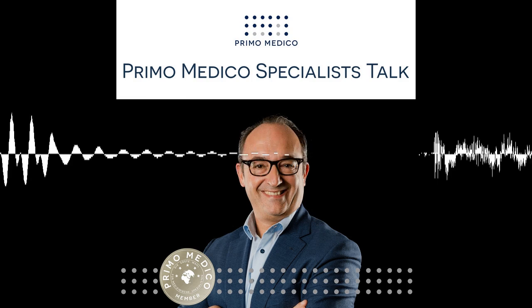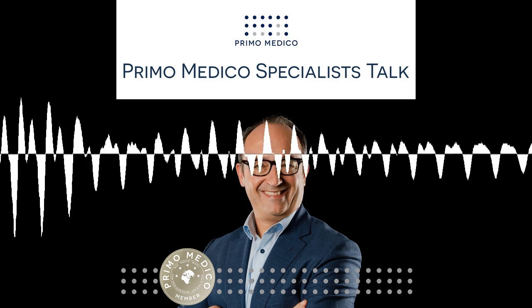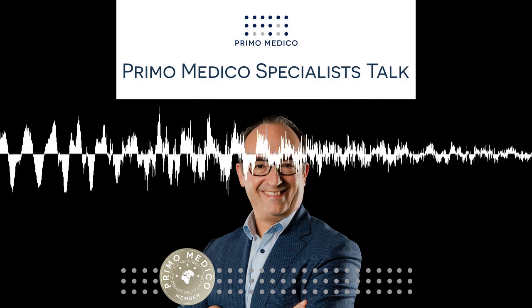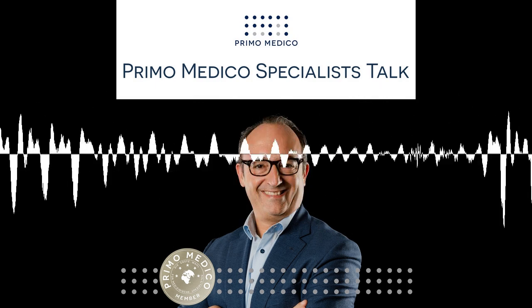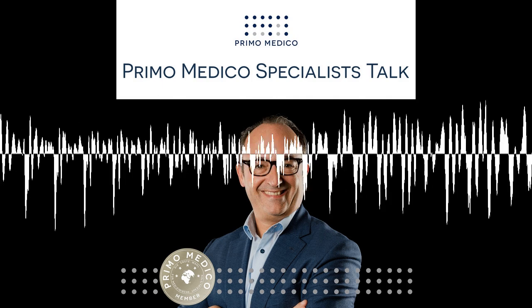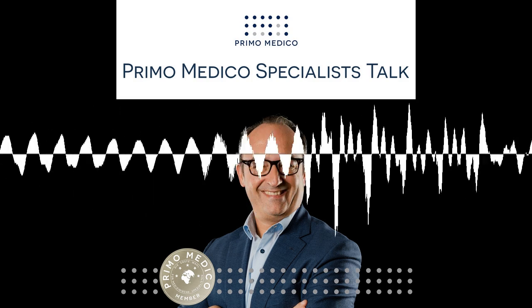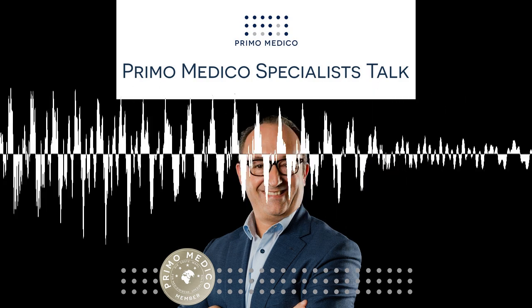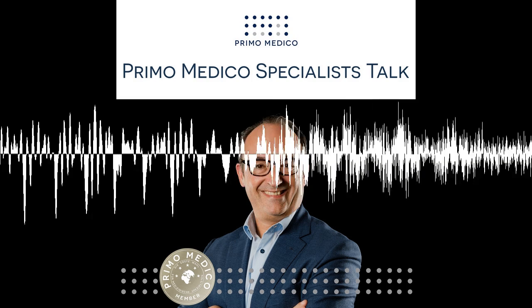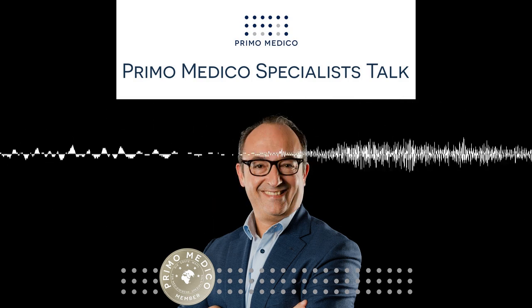How long does a total ankle arthroplasty last? Here it's important that we transfer this knowledge to general practitioners and also patients, because there's still a little bit the information that they don't last very long, and this is not correct. According to the literature, the survivorship of a total ankle arthroplasty is about 80% up to 15 to 20 years. So if we implant today 100 patients, in 15 to 20 years, 80% of us still have the total ankle implanted. The other ones had a revision or a change.